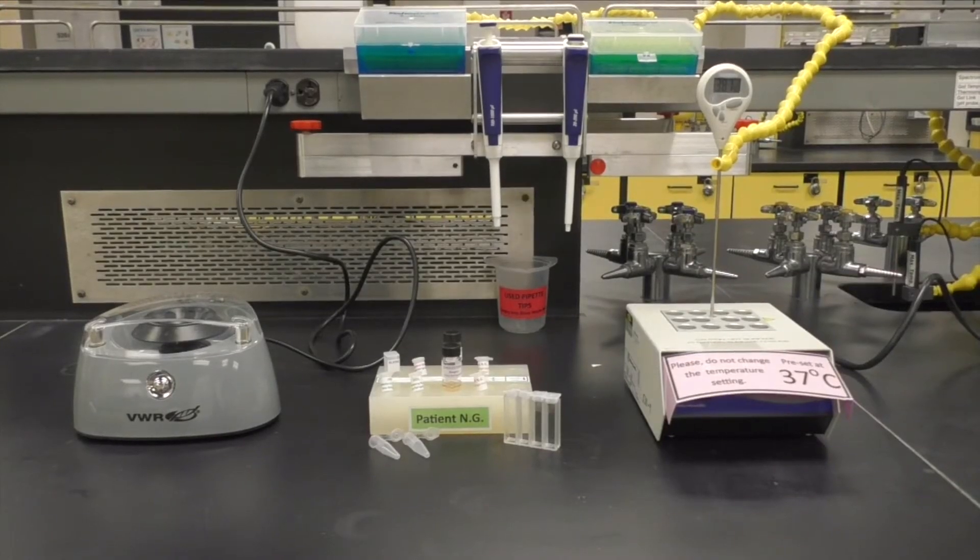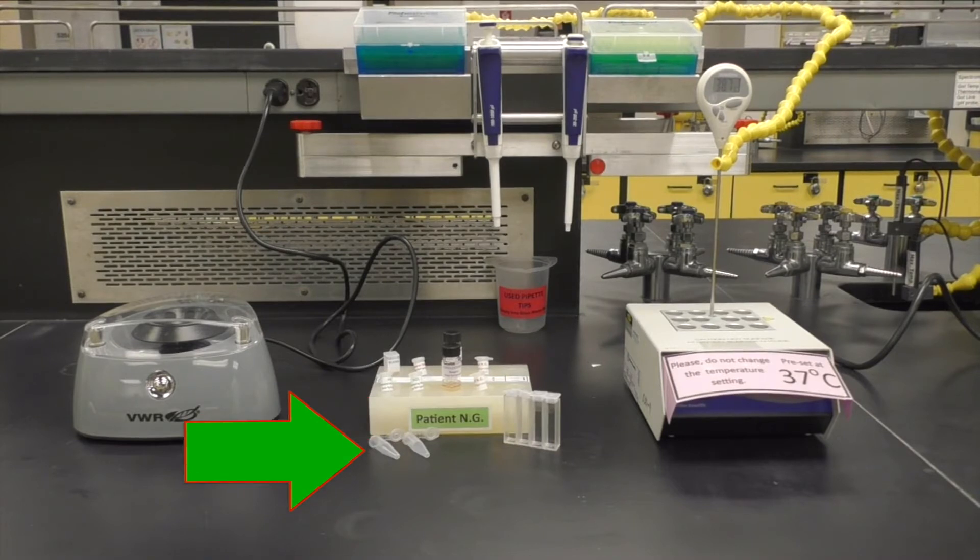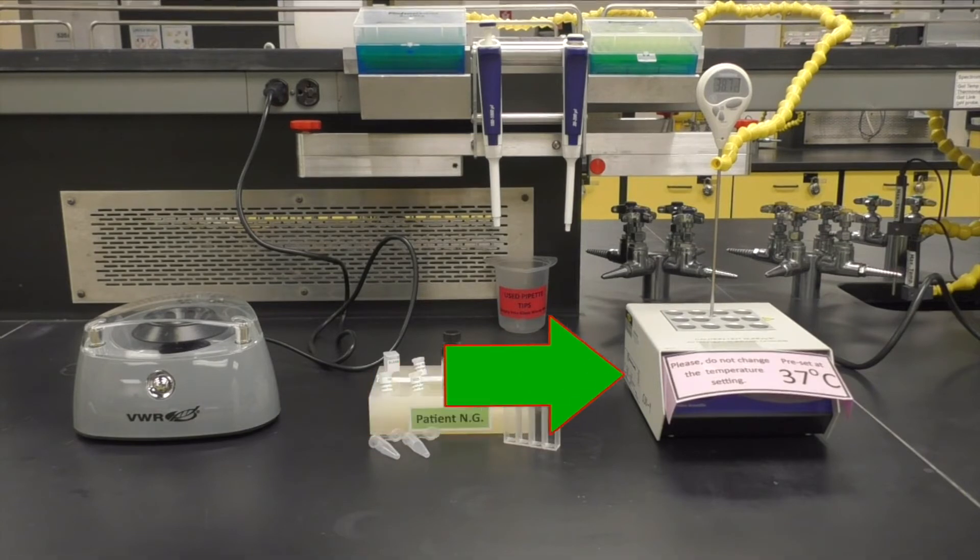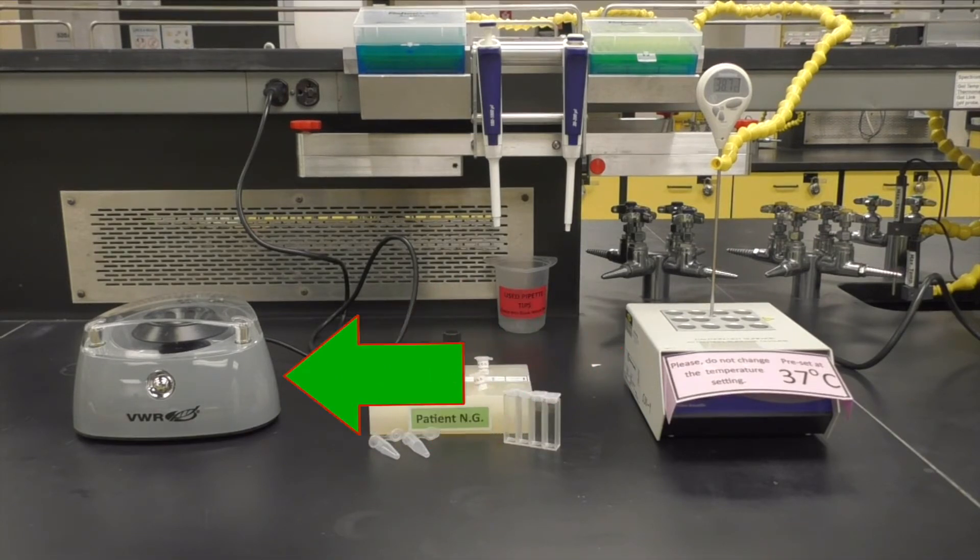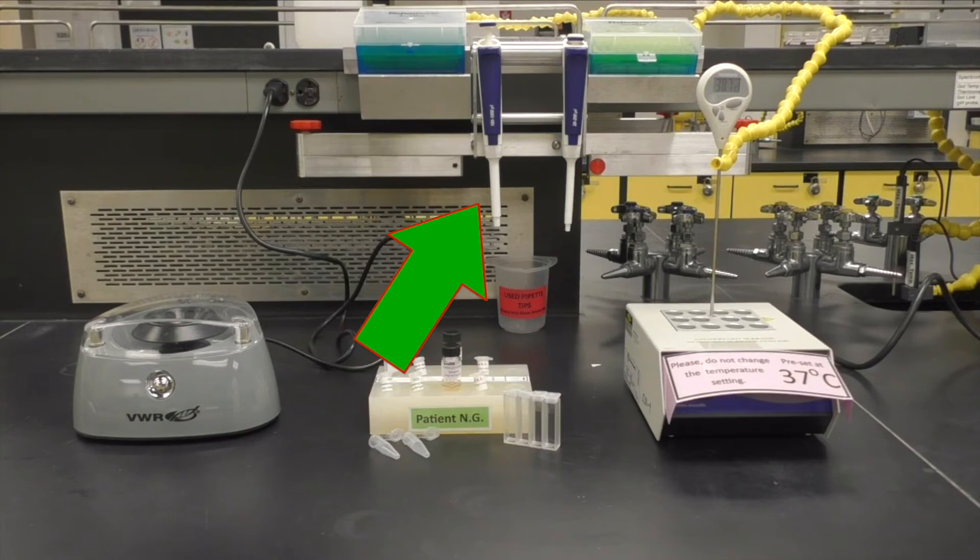To perform the experiment, you'll need your patient block, two new microfuge tubes, four new cuvettes with caps, a dry bath set to 37 degrees centigrade, a mini centrifuge, and your micropipettes and tips.